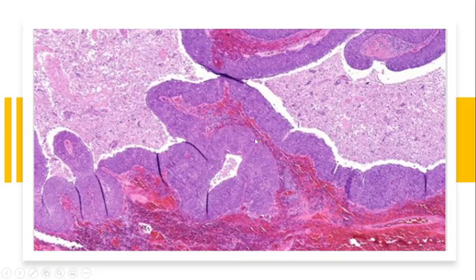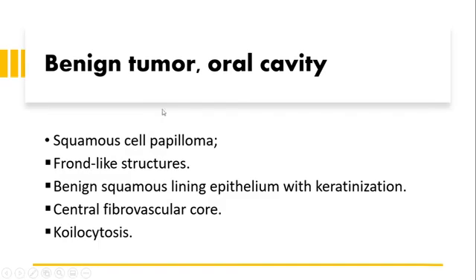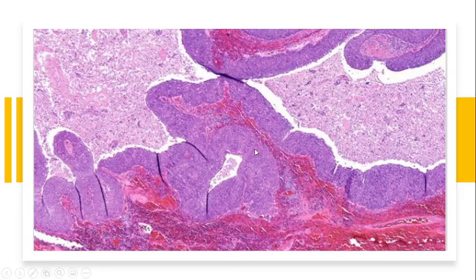Mature lymphoid tissue is seen within the wall, underlying the epithelium. And here the content is fluid, serous or mucinous content, and necrotic debris within the lumen.